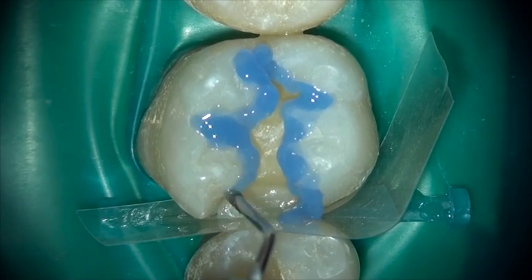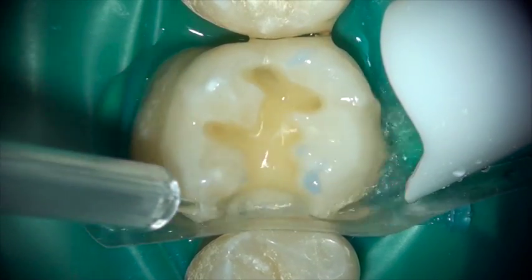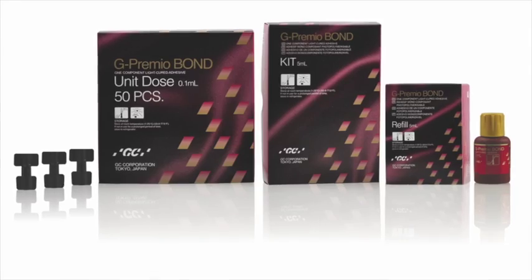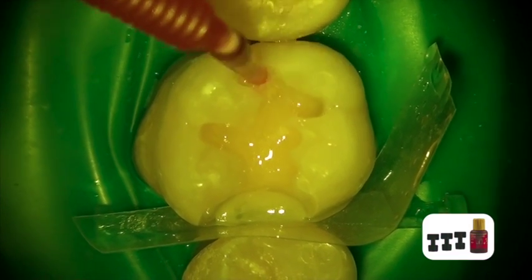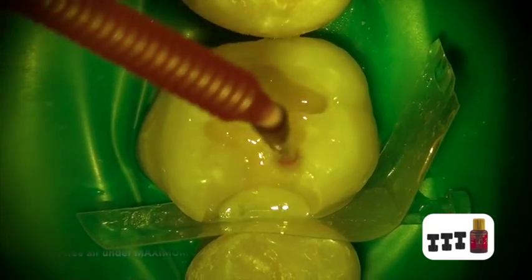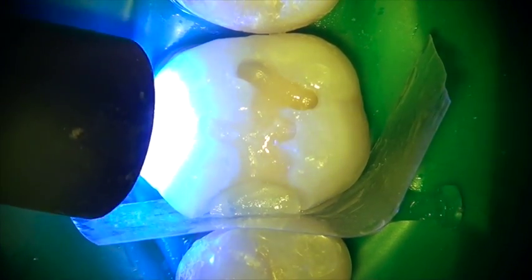You use 37% phosphoric acid on the enamel surface. We are then going to use the G-Premio Bond, an eighth-generation bonding agent. The G-Premio Bond is placed with a micro-brush, slightly scrubbed into the tooth structure, and then light cured.